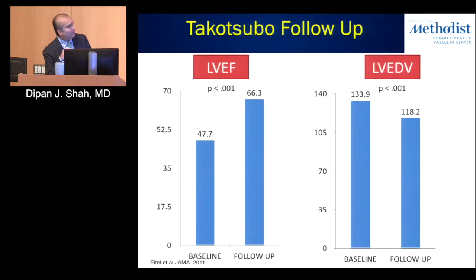And in fact, what they found in these patients was when they were brought back for follow-up, as we know from other echo studies, there's a significant improvement in LVEF at follow-up in these patients, as well as a reduction in LV volumes, and improvement in LV remodeling.